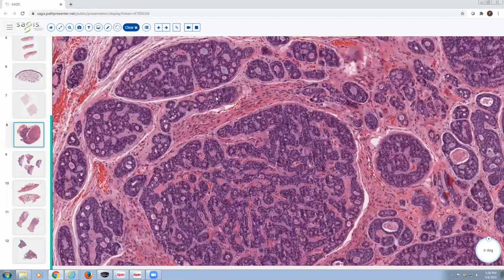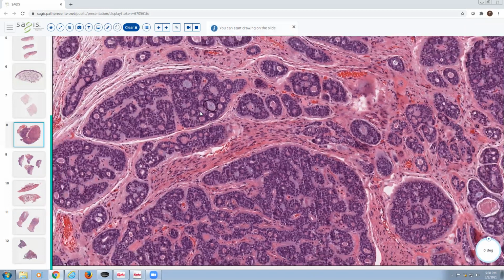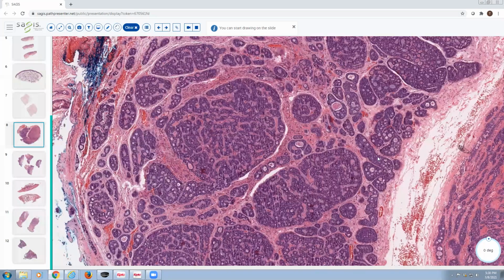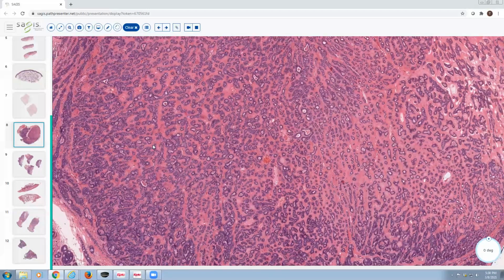So you've got mucinous deposition within holes that are perforating this basaloid epithelial neoplasm that's usually arranged as nodules. Okay, so tons of tiny little holes, and they've got mucin in their stroma and within those holes themselves.